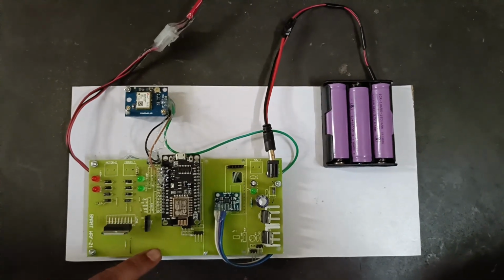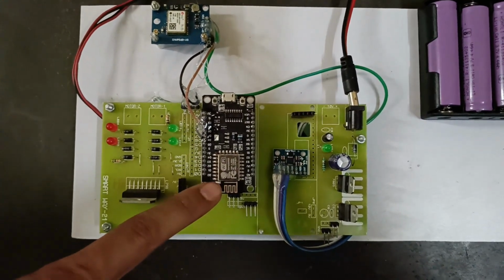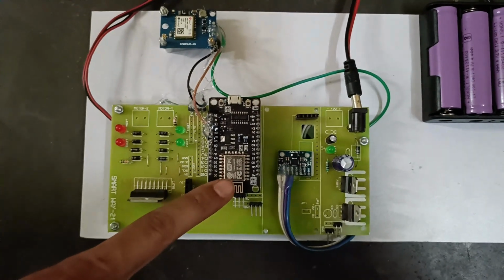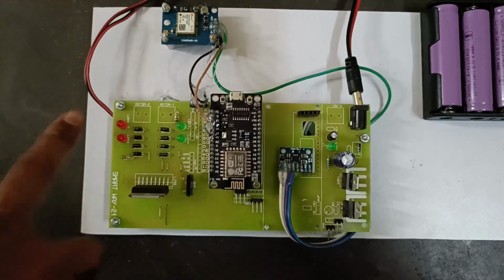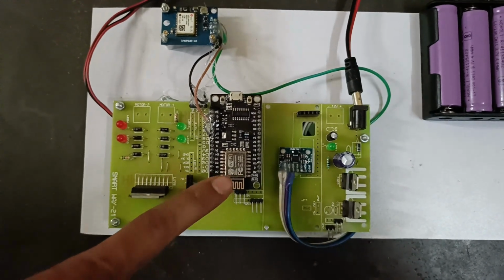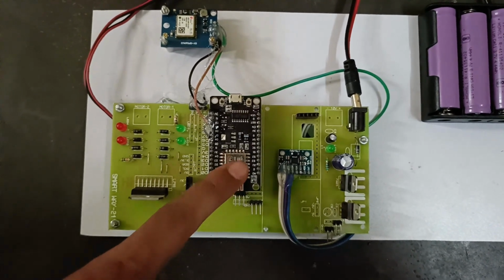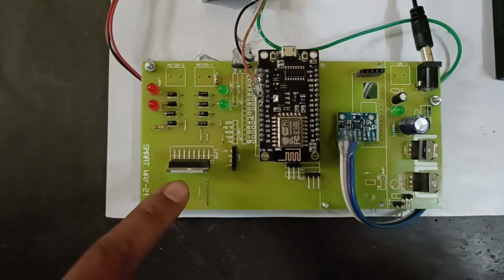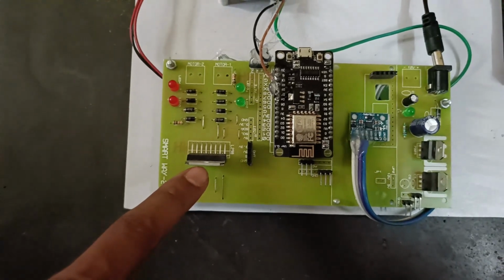On this PCB board, the main microcontroller is the Node MCU 8266, the same controller we used in the transmitting section. The data from the accelerometer, through the user's head motion, is transmitted from the transmitting section Node MCU to the receiving section Node MCU through Wi-Fi. When the receiving section gets the data, it is passed to the L298N motor driver, which drives the motor rotation.